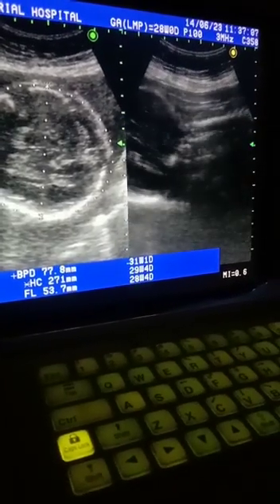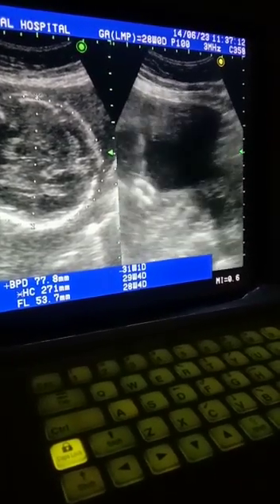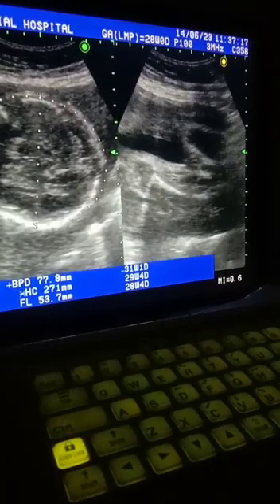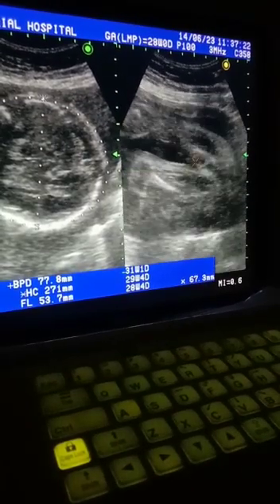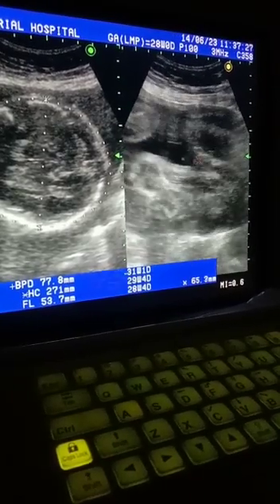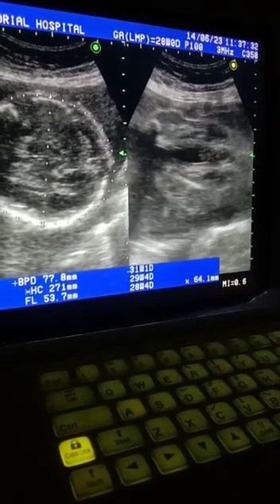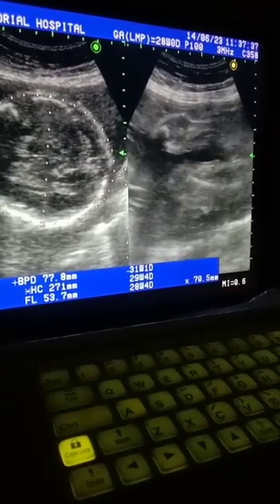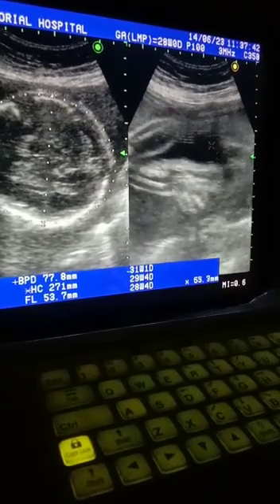This is the head and this is the neck region. This is the gender of the fetus — it's male. This is the scrotum and this is the small penis. These are the knee joints.